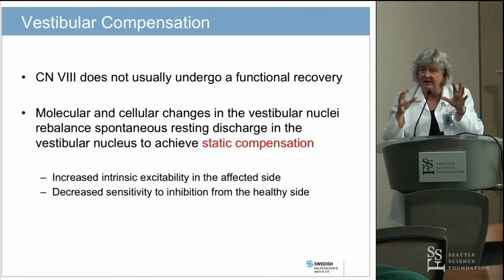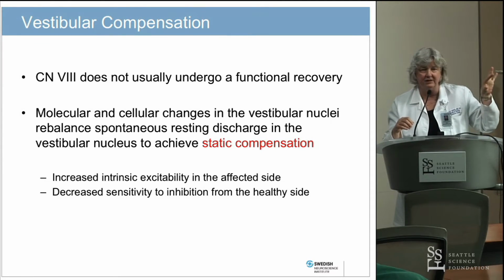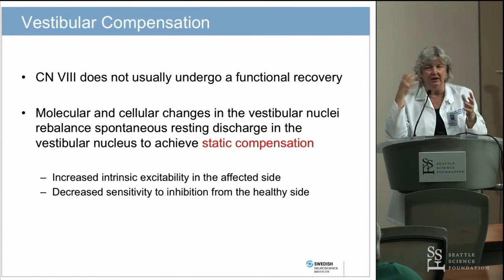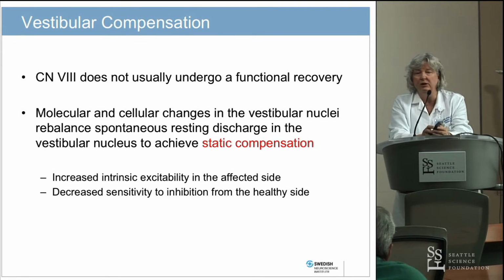The brain looks for all kinds of different stuff. How can it use anticipatory saccades? You're going to turn that way, look that way first. People can get all these different tricks: visual tricks, neck system, proprioception, ramping up the good ear to compensate. But it's different for different people. People weight different sensory modalities differently. So figuring out what your patient is using to compensate and why it isn't working is really quite interesting. And the rotary chair can help with that.